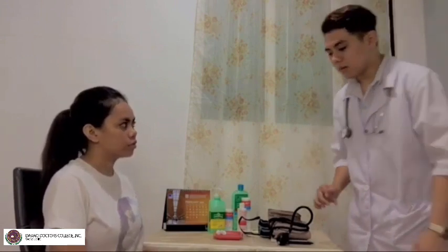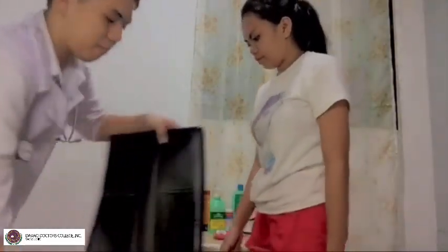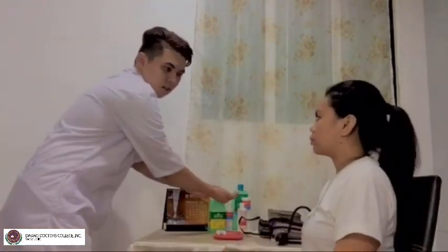Okay, so now, ma'am, we need to make sure that your legs are comfortable. You can stand up, ma'am, we'll just change positions here. Sure. Okay, let's stand up, ma'am. Wait a moment, ma'am, I'll just change the chair. Okay ma'am, you can sit now. Okay. Are you comfortable, ma'am? Comfortable now. Okay.